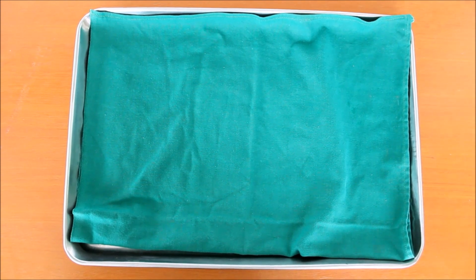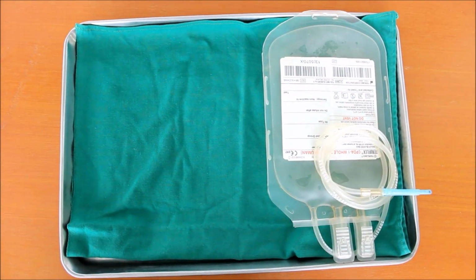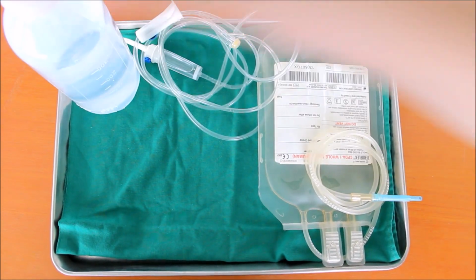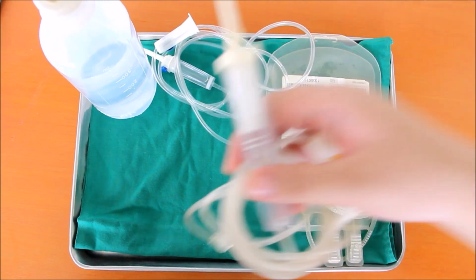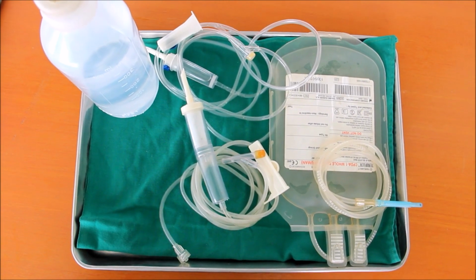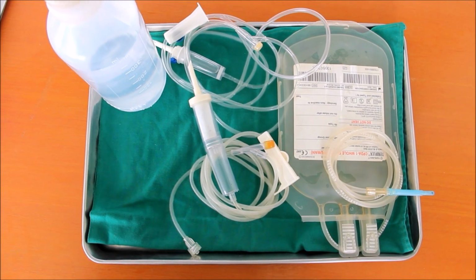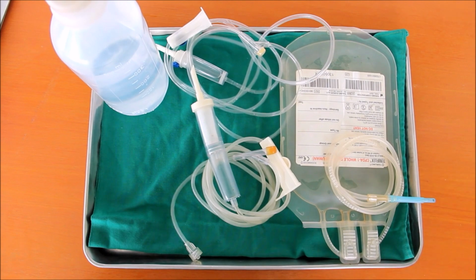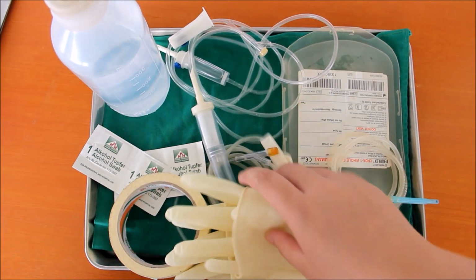For the equipment, you have to have blood product, blood administration set, 250 ml normal saline for infusion, IV pole, venipuncture set containing a number 18 to number 20 gauge needle or catheter, or, if blood is to be administered quickly, a larger catheter, chlorhexidine solution, alcohol swabs, tape, and clean gloves.